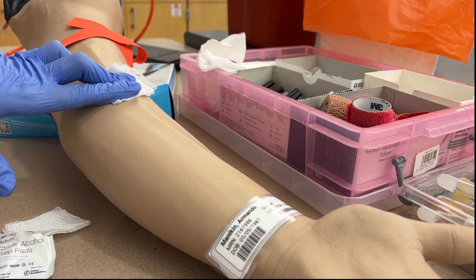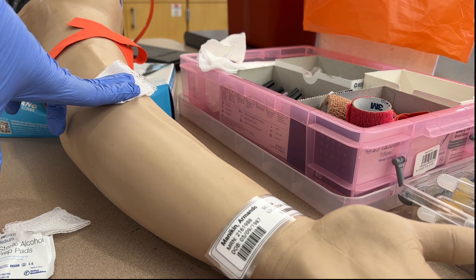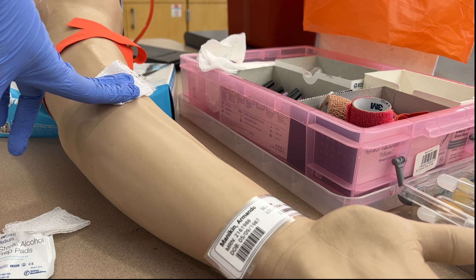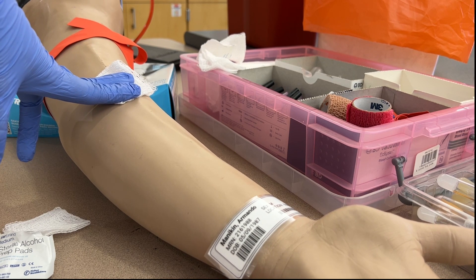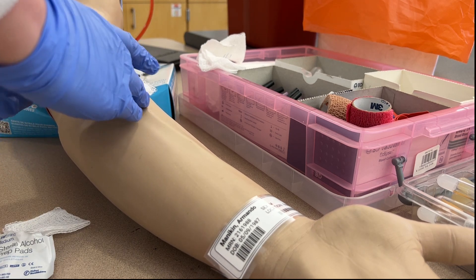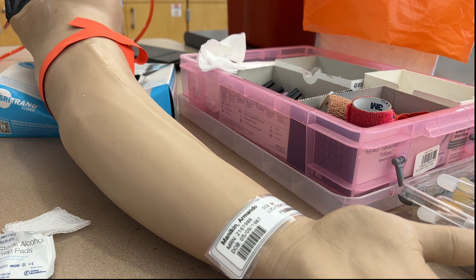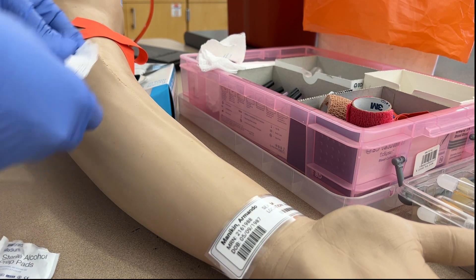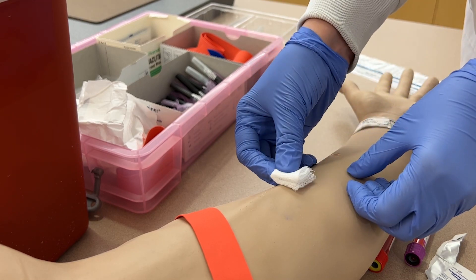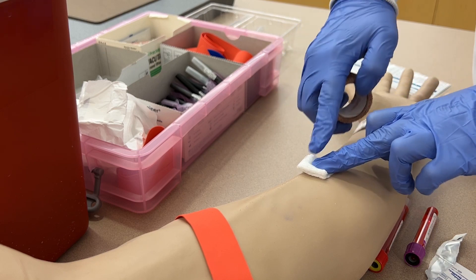Continue to apply pressure until the patient has stopped bleeding, or if the patient has capacity they can apply pressure while you start to label the tubes. It's good practice to assess the patient and ask how they're feeling, because a patient might have a vasovagal reaction which can present as nausea, vomiting, dizziness, or loss of consciousness. Check that the patient has stopped bleeding, then discard the dirty gauze into the biohazard. Take the clean piece of gauze, fold it into quarters, and apply it to the puncture site so that when you bandage the patient's arm that gauze applies additional pressure.